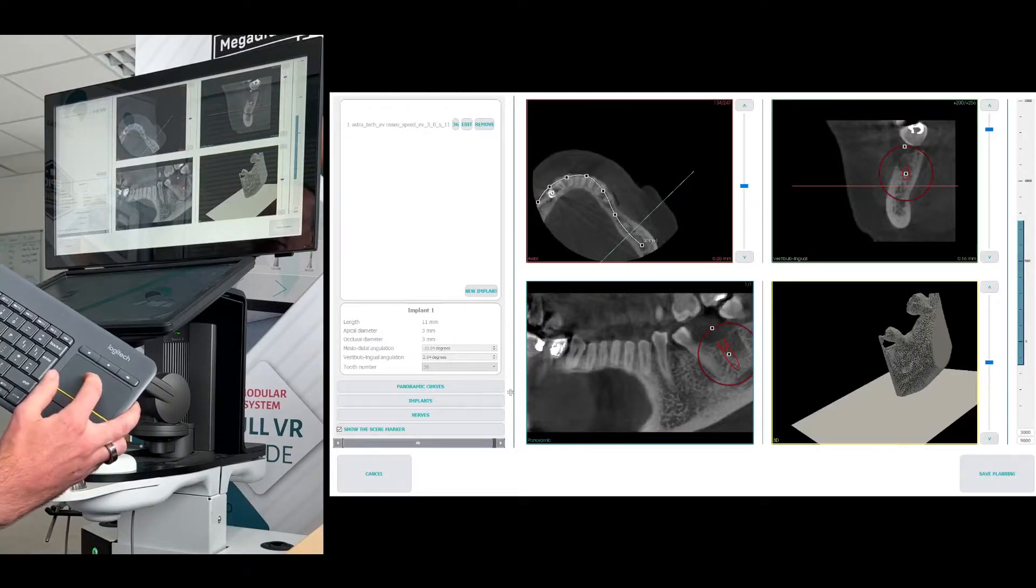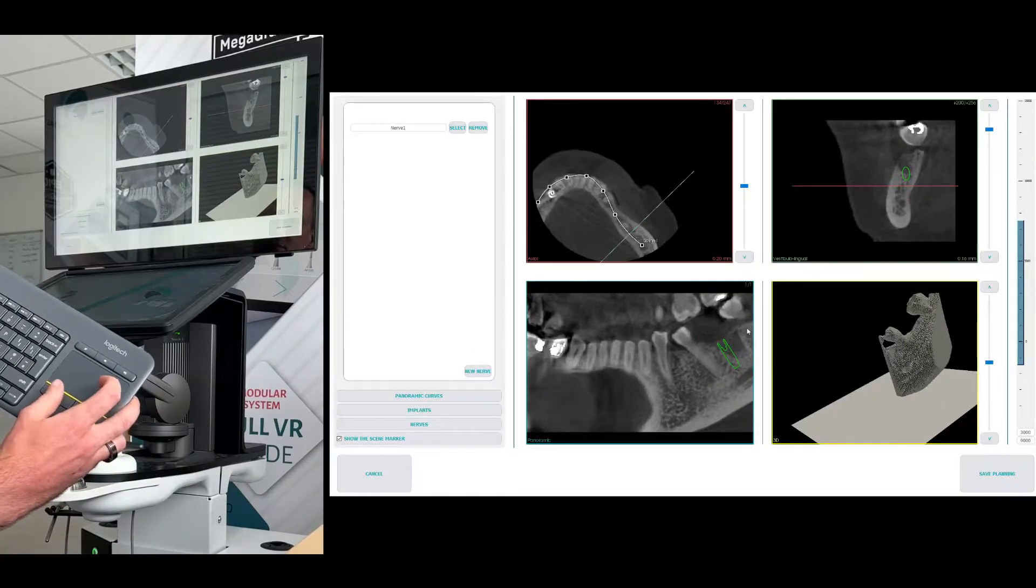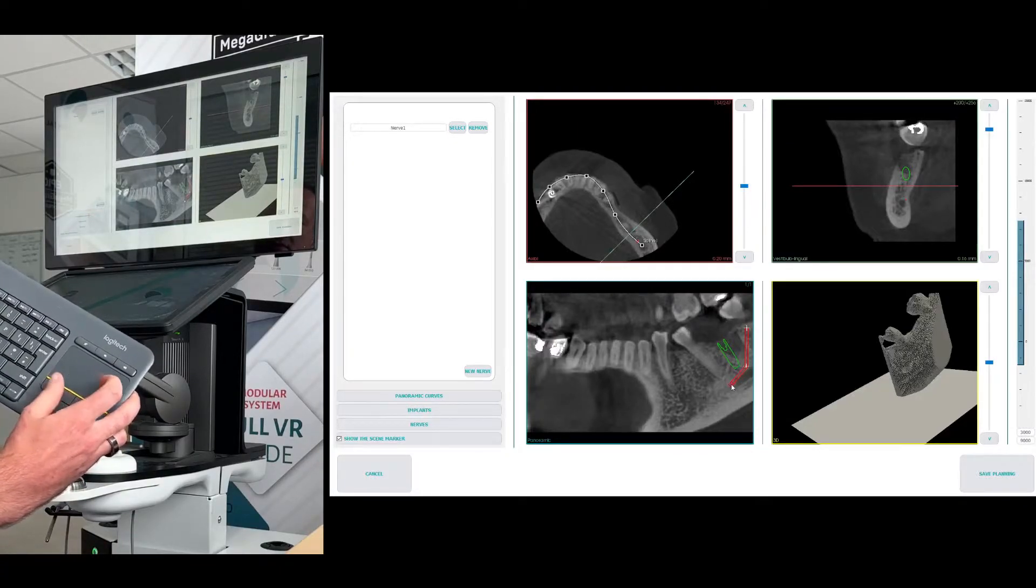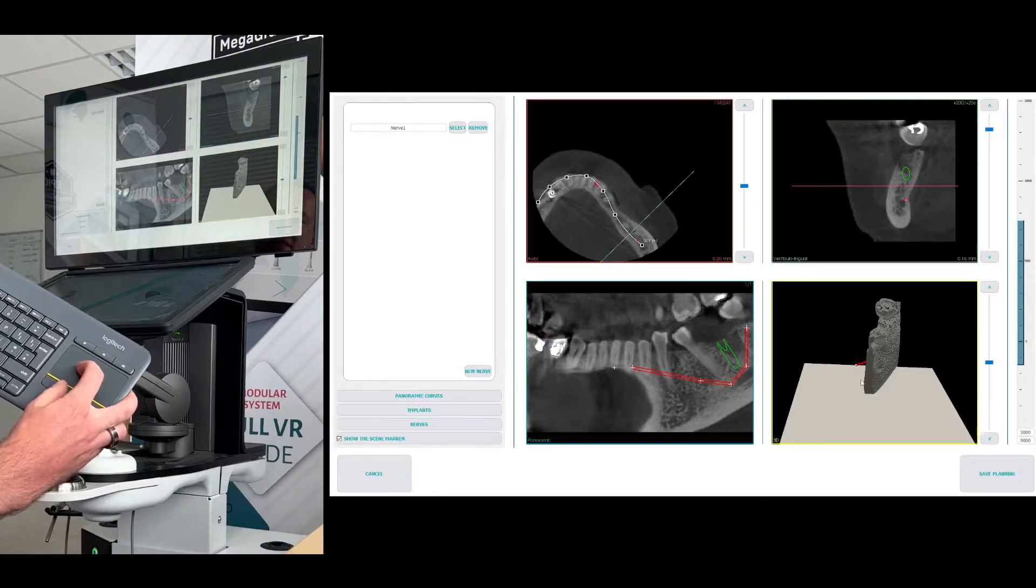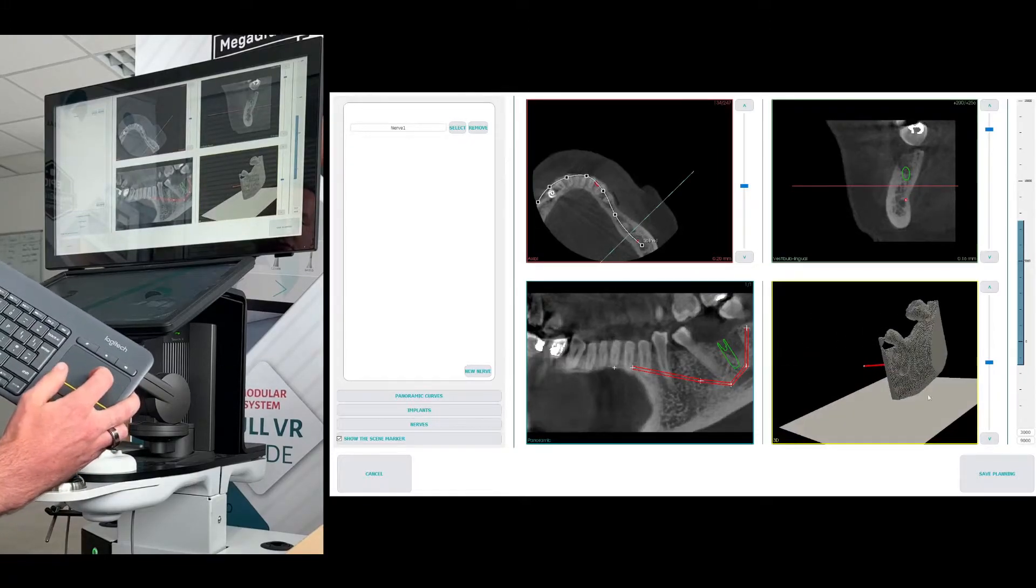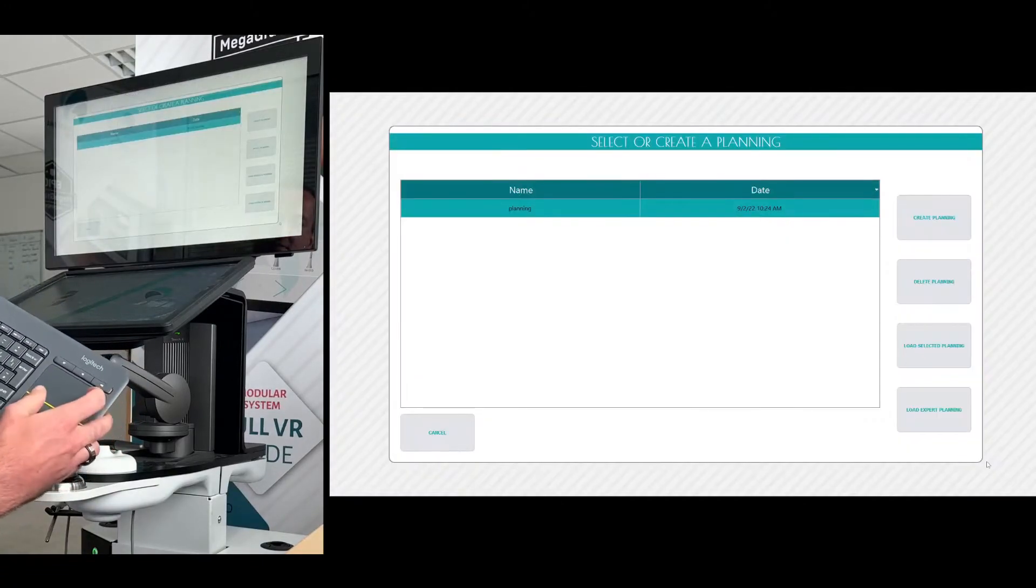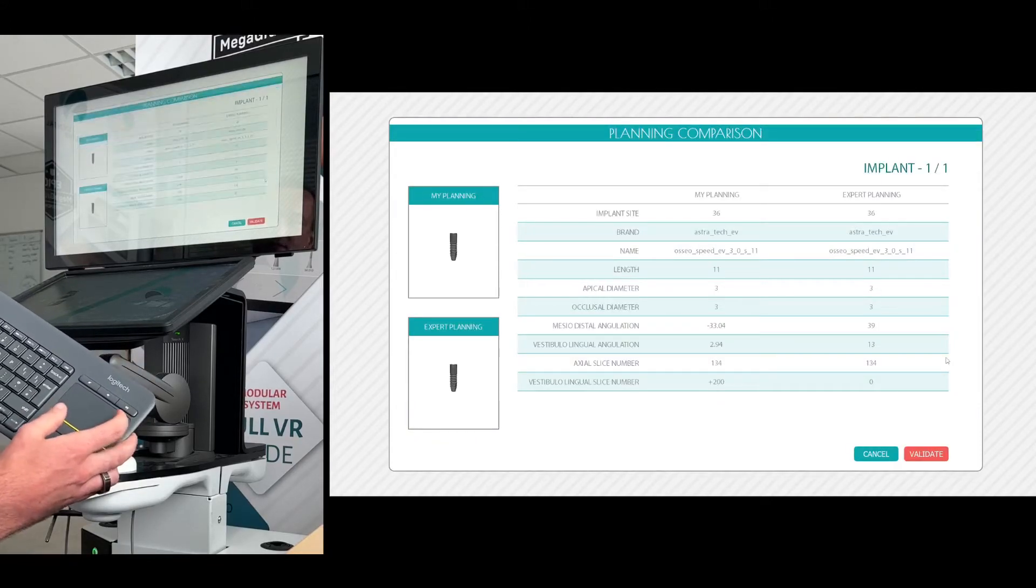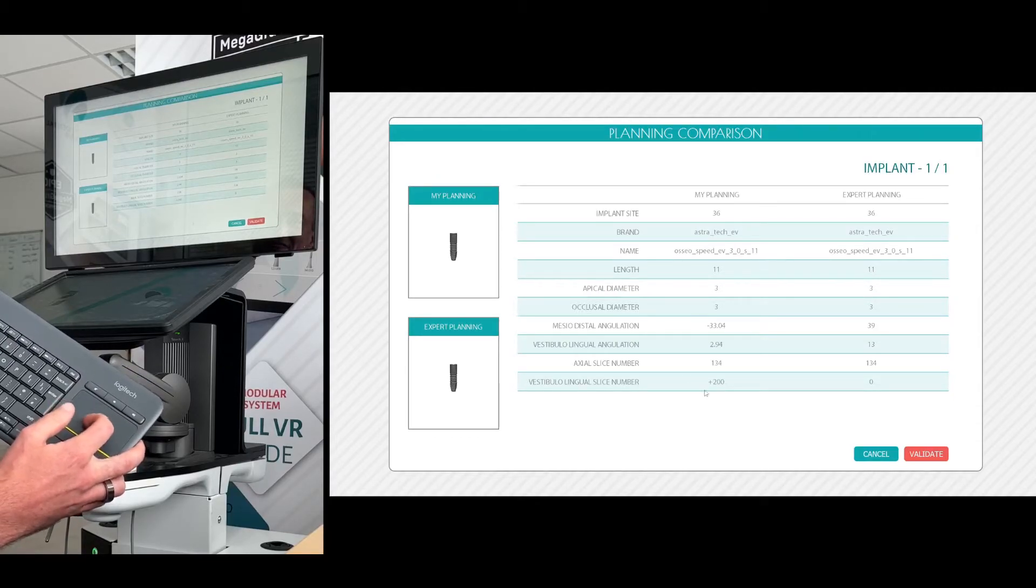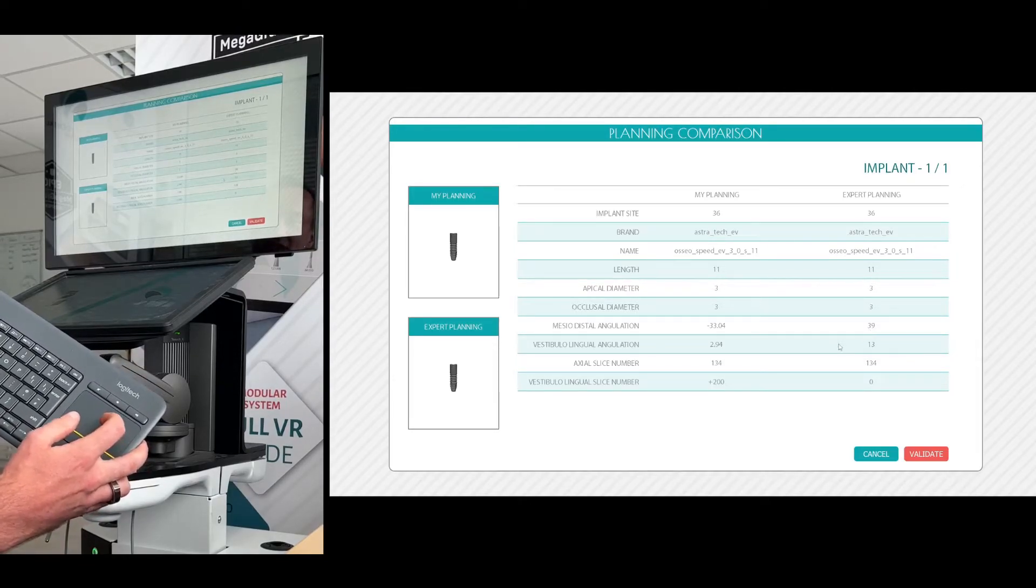I also have nerves which is just for the visualization where you click new nerve. You click once to do the waypoints and twice to finalize it and you'll see there the start of a little visualization as that nerve is coming out of the 3D view. We can click save planning in the bottom right. And now to load that one we just click load selected planning. We've got a comparison between what we've just done together here on the left and what the person who created the exercise saved as the expert planning.